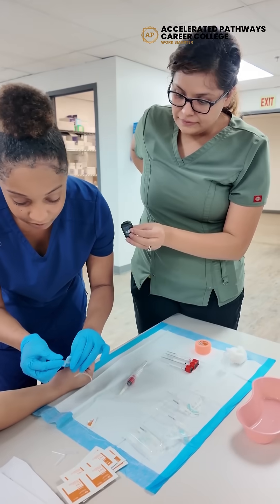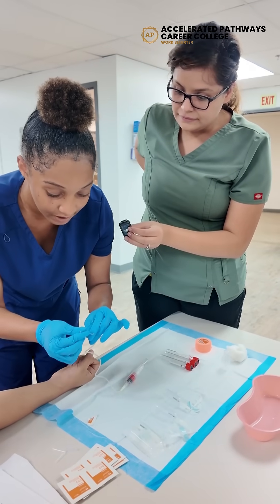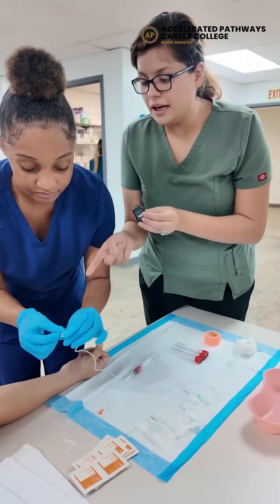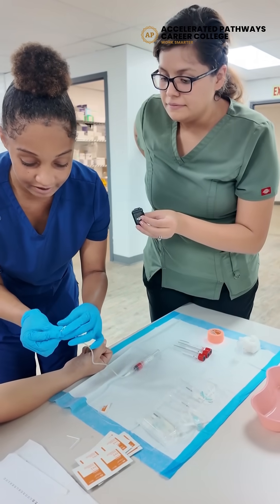What's the next step? And then I will remove the cap of the needle. Does the bevel have to be down or up? The bevel has to be up.